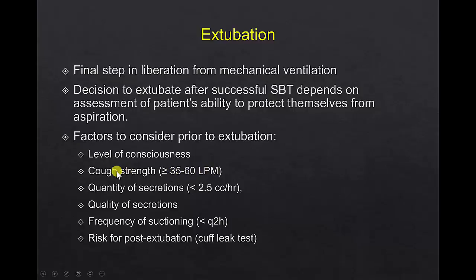Remember, when an endotracheal tube is in, patients actually can't truly cough because they can't close their glottis. Their glottis and their vocal cords are held open by the endotracheal tube. Some people technically refer to a cough maneuver on a ventilator as a huff, H-U-F-F maneuver. You sort of just blow out the air without closing your glottis.